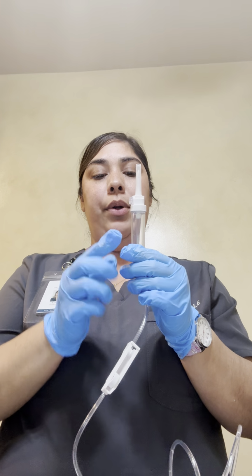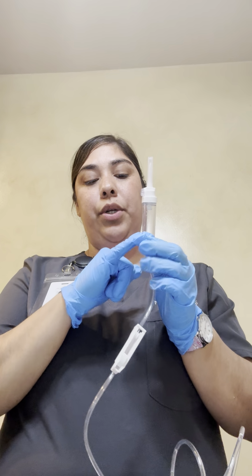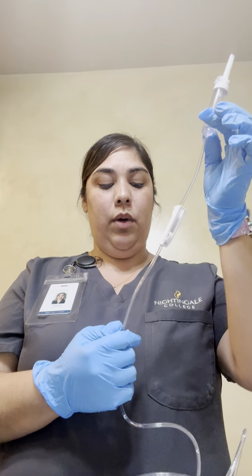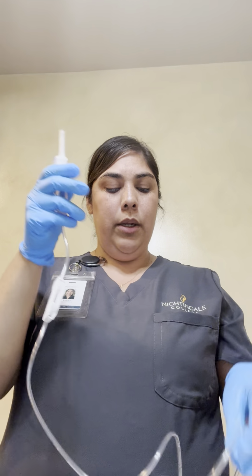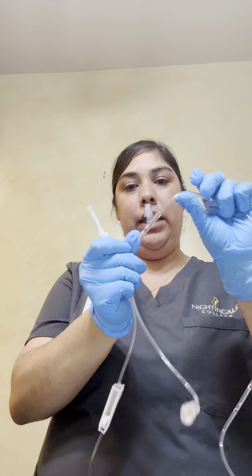This is our chamber, where when we squeeze it, we will fill it up halfway. This is where we can monitor the drips. This is our rolling clamp, where we can adjust how fast we want it to go, and also prime our tube, which we will be doing. This is the Y site, which literally looks like a Y.